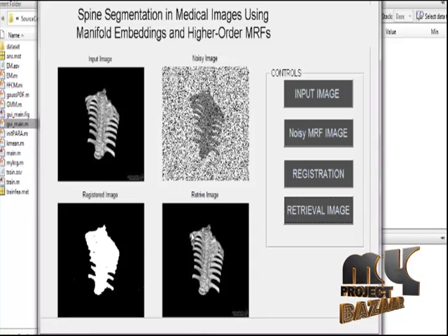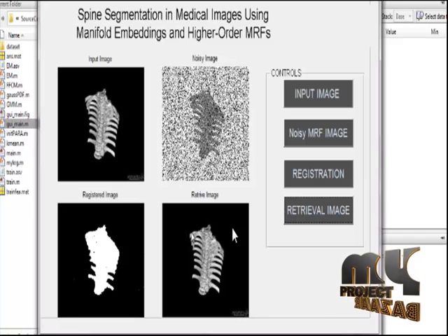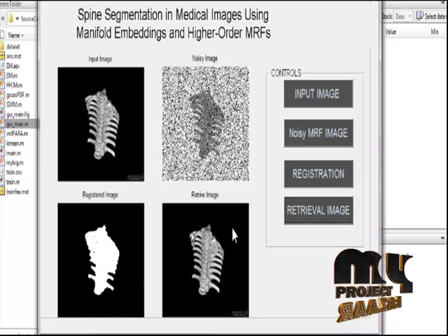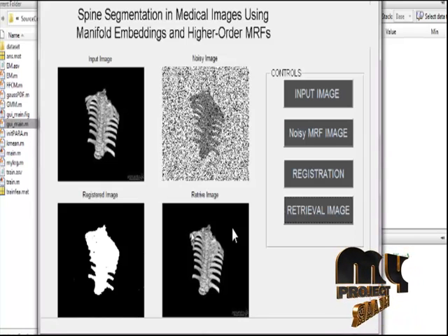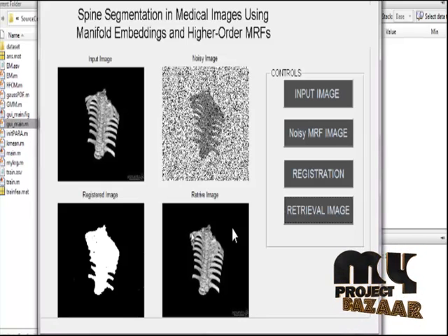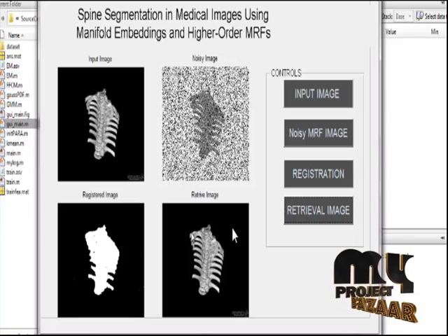They conclude that the spine medical images can be clustered using the Markov random field method, and from those shape models we obtain the registration based segmentation model. Check the perfect match from the previously saved images for the input images to see which shape is perfect, and then finally segmentation can be employed. Finally, the 2D images can be used as input and clustering is employed using the Markov random field model to obtain the modeling of the 2D images.